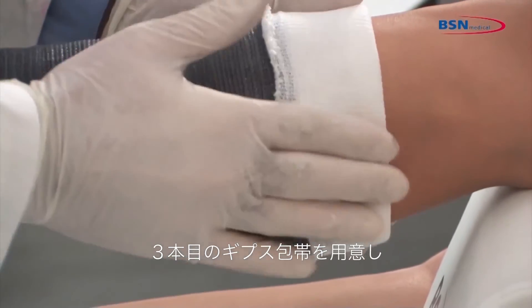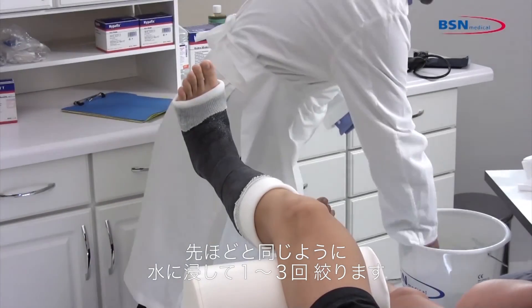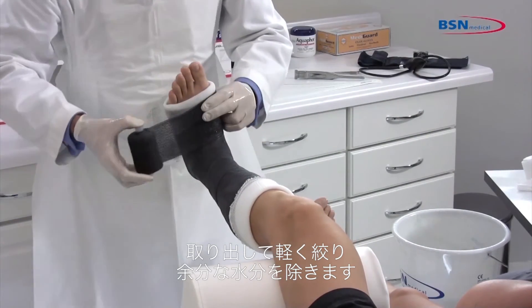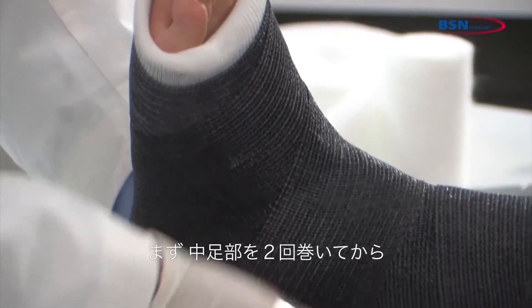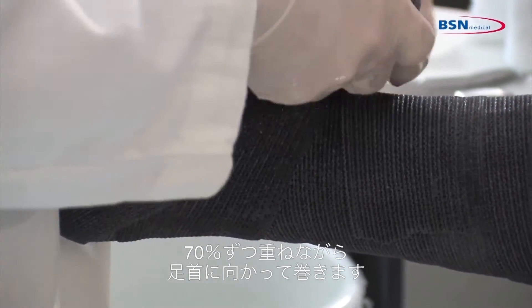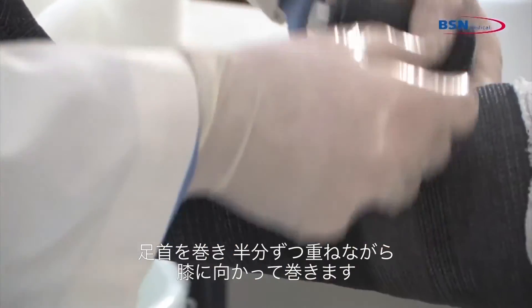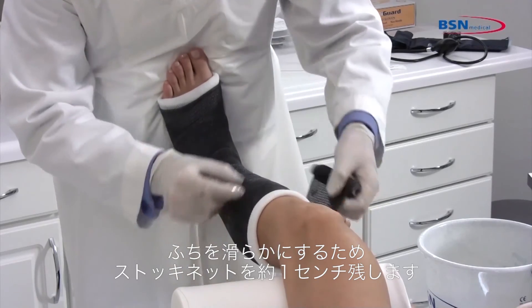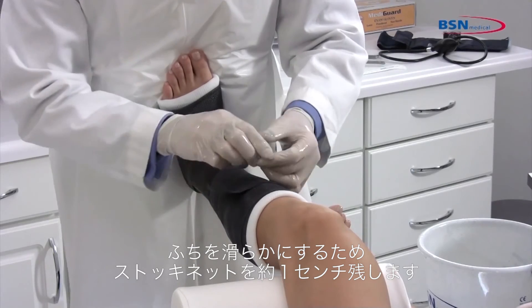Now take a third roll of cast tape. As you did before, dip the cast tape in water, squeezing 1 to 3 times. Remove from water and squeeze 1 time to remove excess water. Start wrapping the cast at the metatarsals twice and work toward the ankle with 70% overlap. Go around the ankle and work toward the knee with 50% overlap. Be sure to stay below the fibular head and leave approximately 1½ inches of stockinette exposed to leave a soft end.